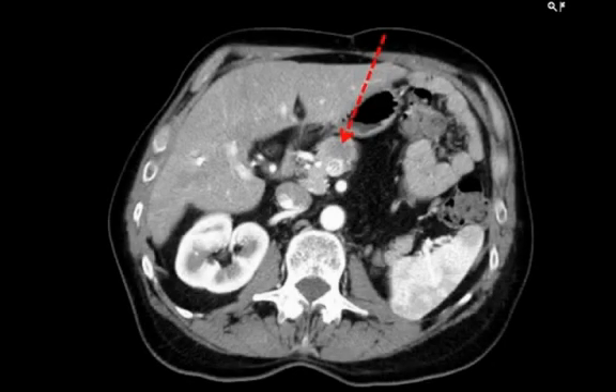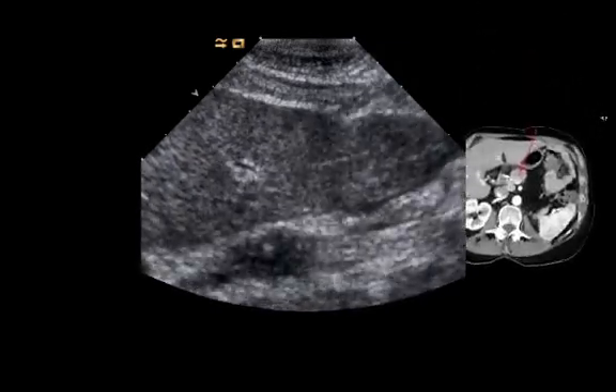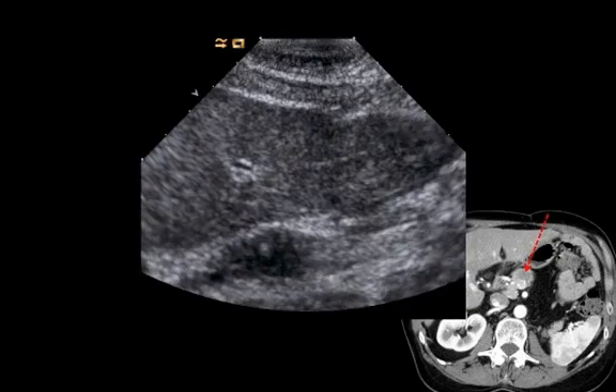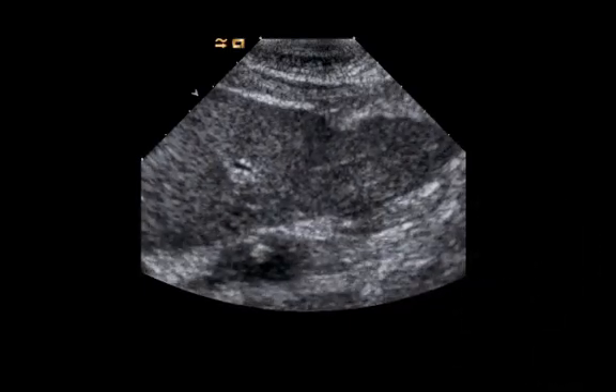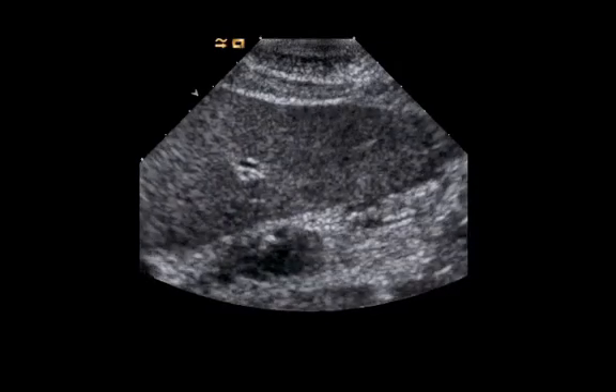In this image you can see a tumor in the pancreas. The Gold Anchor needle is inserted through the liver, through the stomach, into the middle of the lesion. There the Gold Anchor is deployed and the needle is extracted swiftly.